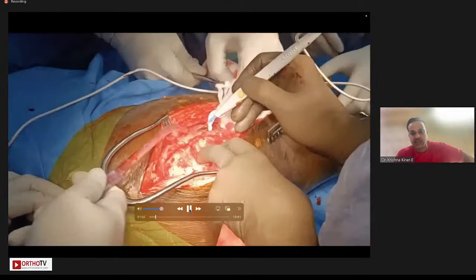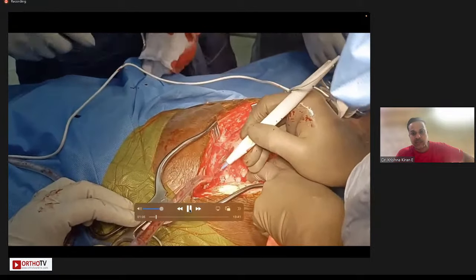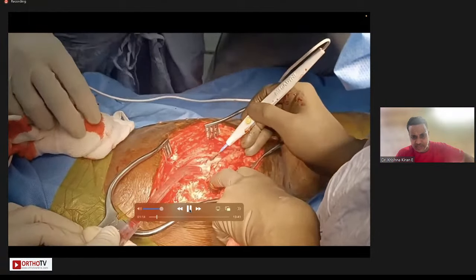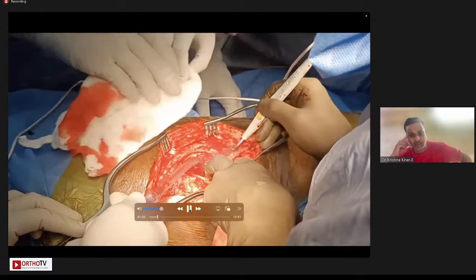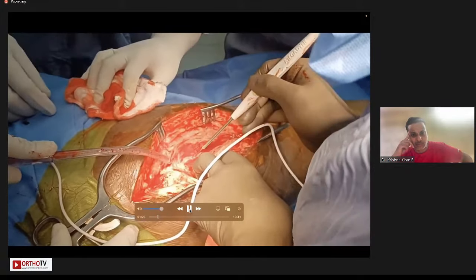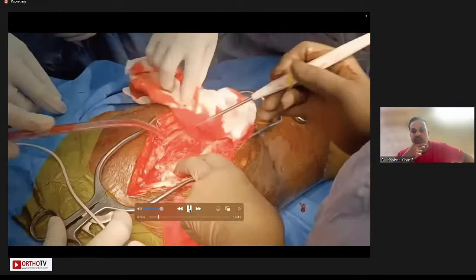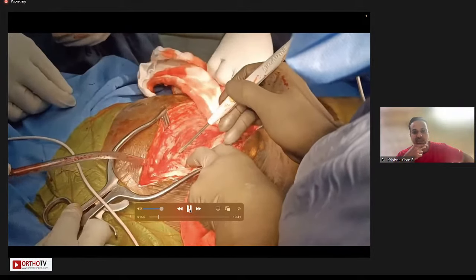So you can see here where there's an alternative exposure method, which has been popularized by the Adelaide group. So you can see I'm cutting more of the muscle towards the posterior side, and the scar tissue will now be excised. Again, the key steps are to identify the posterior border of the abductor, the posterior border of the greater trochanter, and stay close to the posterior border of that. And whenever we are doing acetabular reconstructions, which are more massive, we need to keep a watch on the superior gluteal neurovascular bundle, which comes from the greater sciatic notch. So that is a key step.